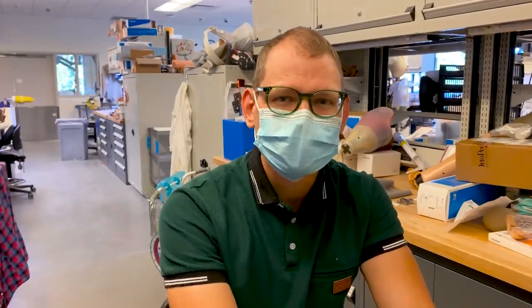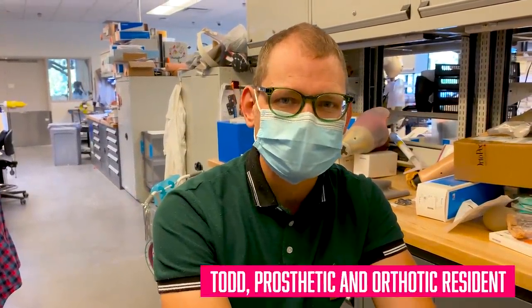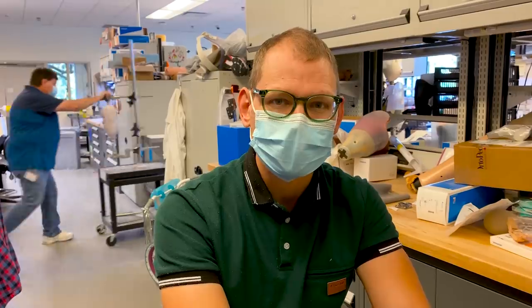So far, we've mainly talked about upper limb devices, and you might be wondering, is there something for the leg, for the lower limb? And the answer is yes. There's something called a microprocessor chip-controlled knee. So I'm seeing a person right now that has an above-knee amputation. So for them, we made a prosthesis that has a knee joint incorporated into it.